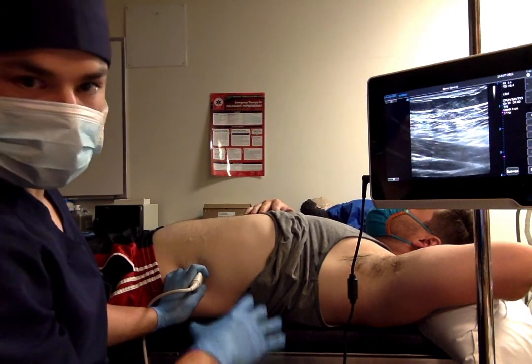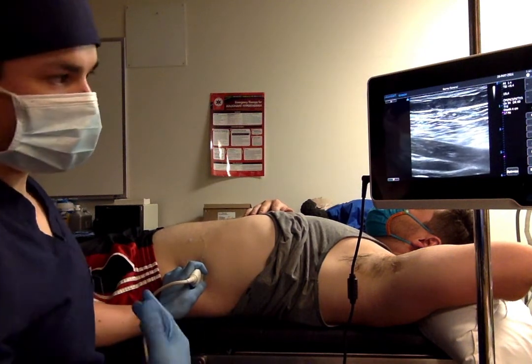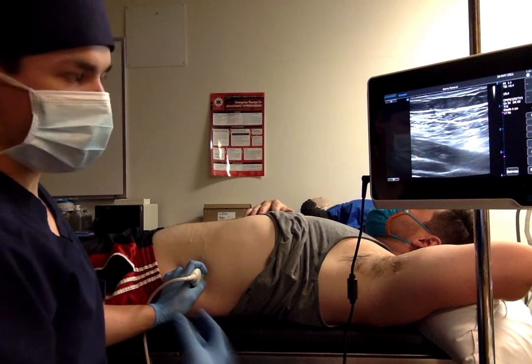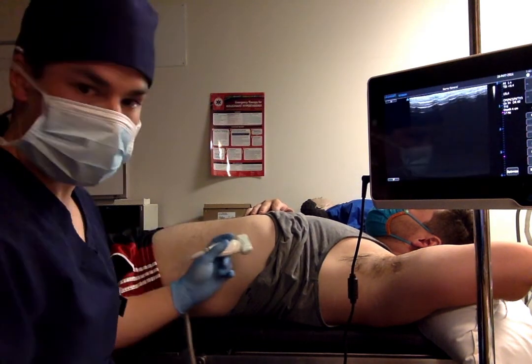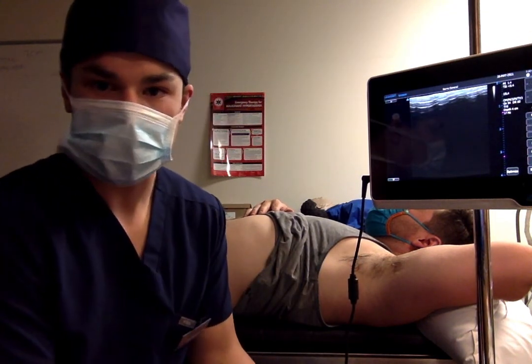This is only going to cover one side of the abdomen, so I'd repeat it on the other side if we were doing a full abdominoplasty, including both sides. Once I'm done with this procedure, I'm going to document everything and continue to monitor my patient throughout the procedure.